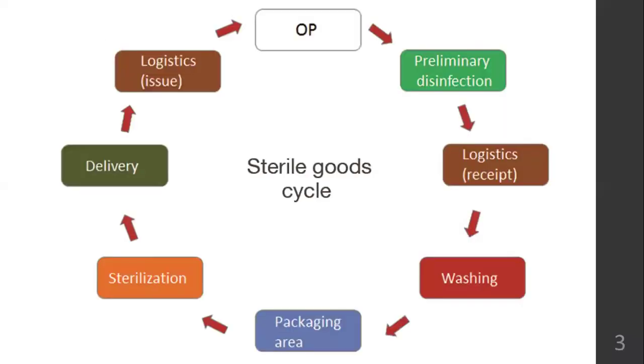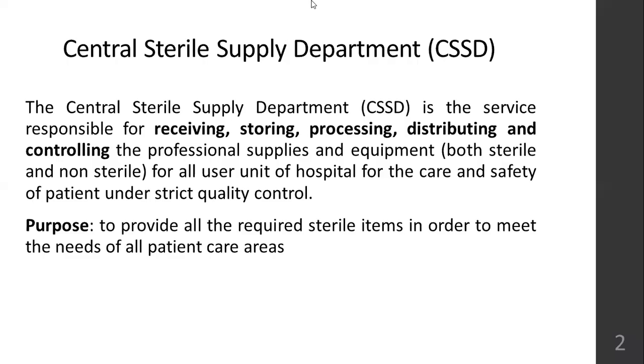So the main purpose of CSSD is to provide all the required sterile items to the user departments. User departments are the clinical departments, in order to meet the needs of all patient care areas. This is the main purpose of CSSD.